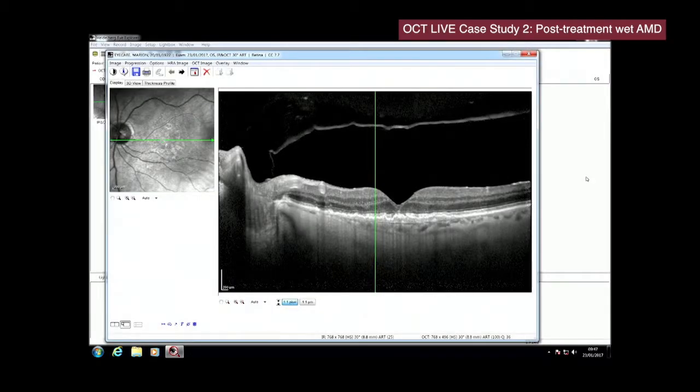So when we're thinking about subretinal fluid, the first thing that immediately springs to mind, obviously, is wet macular degeneration and choroidal neovascularization as the cause. To that list, I think we also need to be thinking about other possible causes. So again, it could be choroidal neovascularization secondary to myopia, high myopia. That needs to be added to your list. A very common occurrence and common presentation to optometric practice, obviously, is patients with central serous retinopathy. Increasingly, though, we're seeing CSR in older subjects.